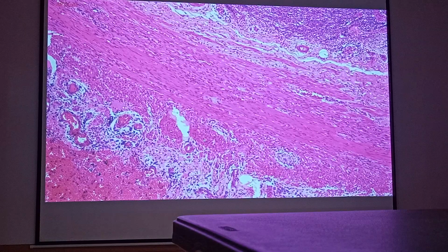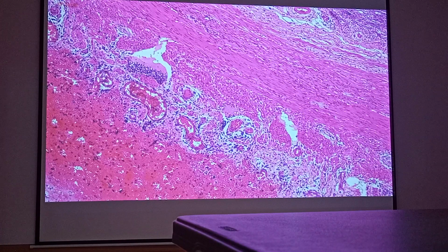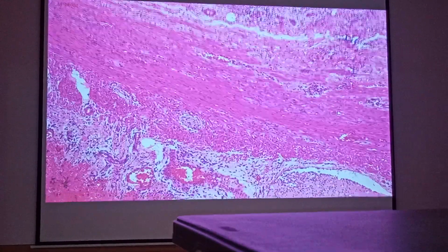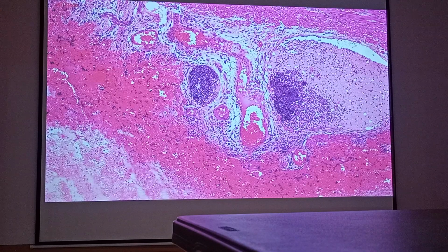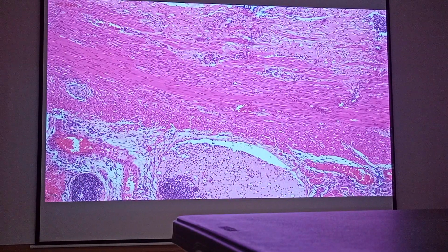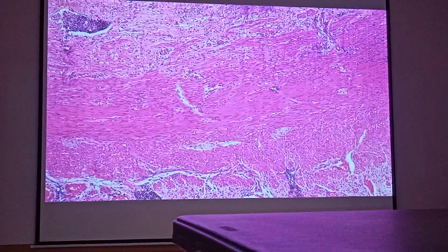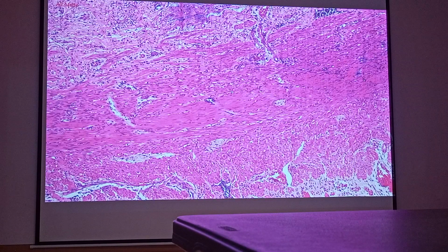Okay, there are other evidences of acute inflammation here. What is the status of that blood vessel pointed? Congested. Okay, so there is also edema in the pointed areas. So neutrophilic infiltration, and then, okay, inflammation has extended into the serosa layer already, external to the muscularis propria. Now, the main requirement to come up with the diagnosis of acute appendicitis is to see neutrophils infiltrating the muscles.